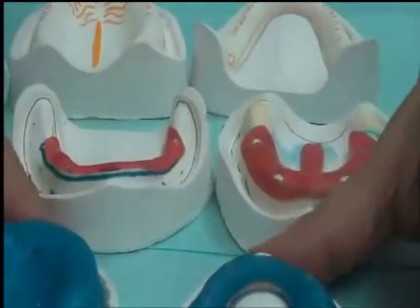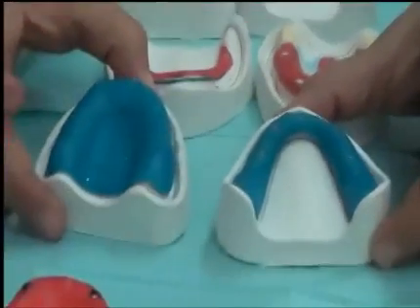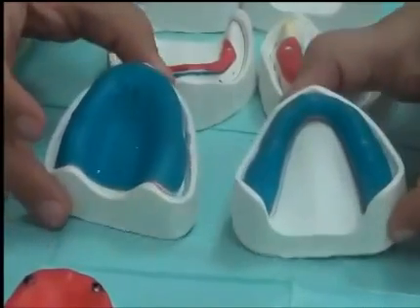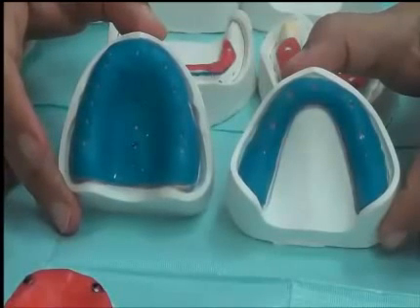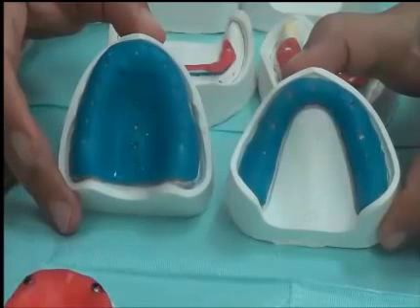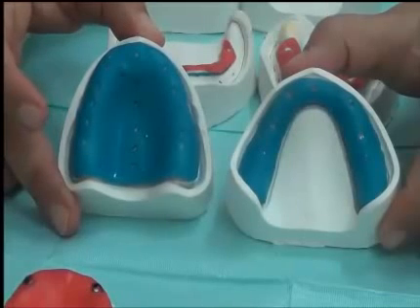Another method is to make a tray without any spacer, but these are supposed to be trays, they're going to be completed as trays, but just to show you that in the areas where we want to relieve, we can place holes in the tray itself, the solid material. So even if a tray comes from the lab to you with no perforations and no spacers, you can add in the drilling of the holes by using a bur.